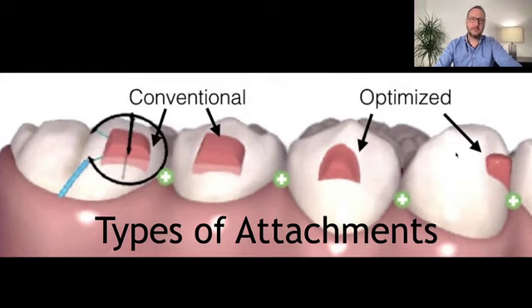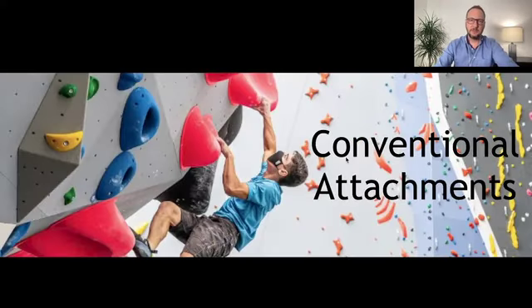And then there is something that Invisalign developed, the optimized attachments. These attachments come from the technician, from the software, and they don't have one specific shape and size; it depends on the movement that we are doing. Not only is the attachment itself going to create force, but the shape of the plastic also changes. Let's discuss this in a moment.